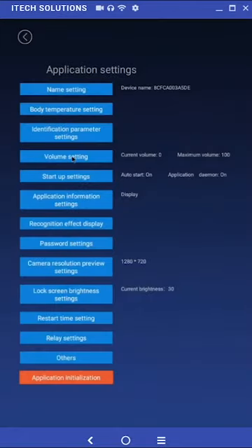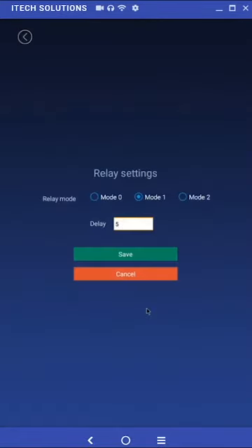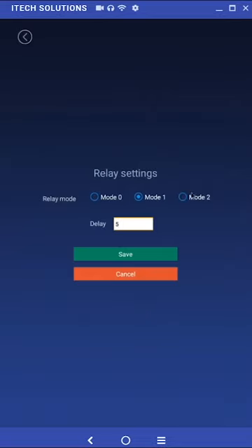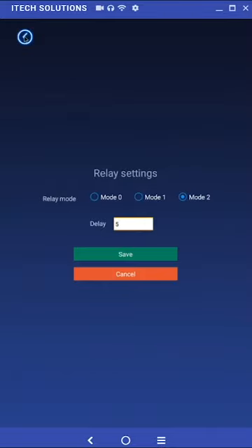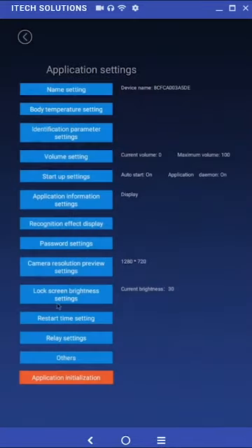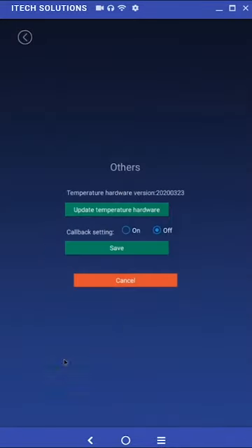Relay settings. There will be three different modes you can choose from. Below these options is the relay delay setting. Using the relay functionality the unit can be used in conjunction with doors, locks, lights, and other devices. Others is where you'll find the temperature hardware version and callback settings which are disabled on the current firmware.